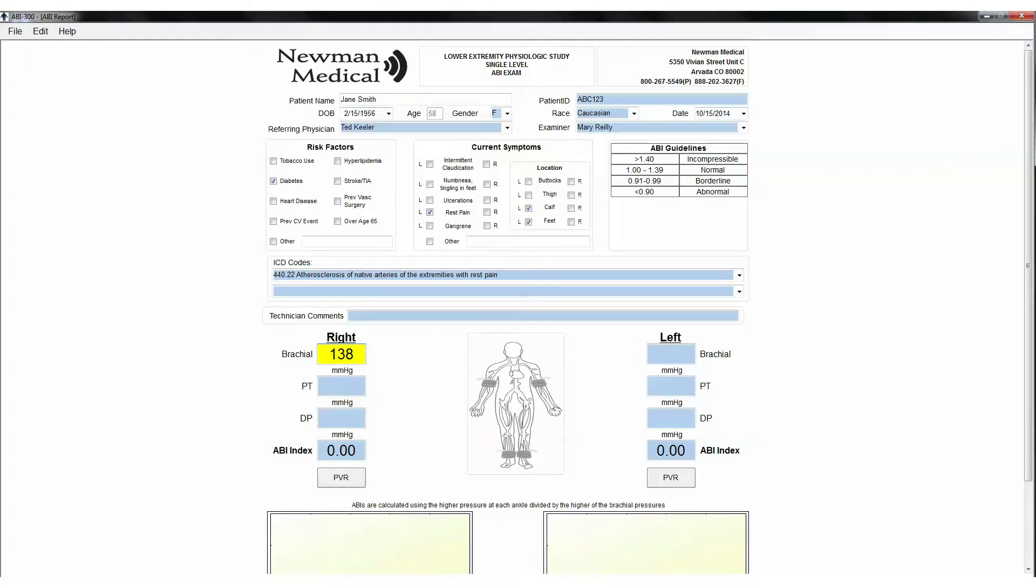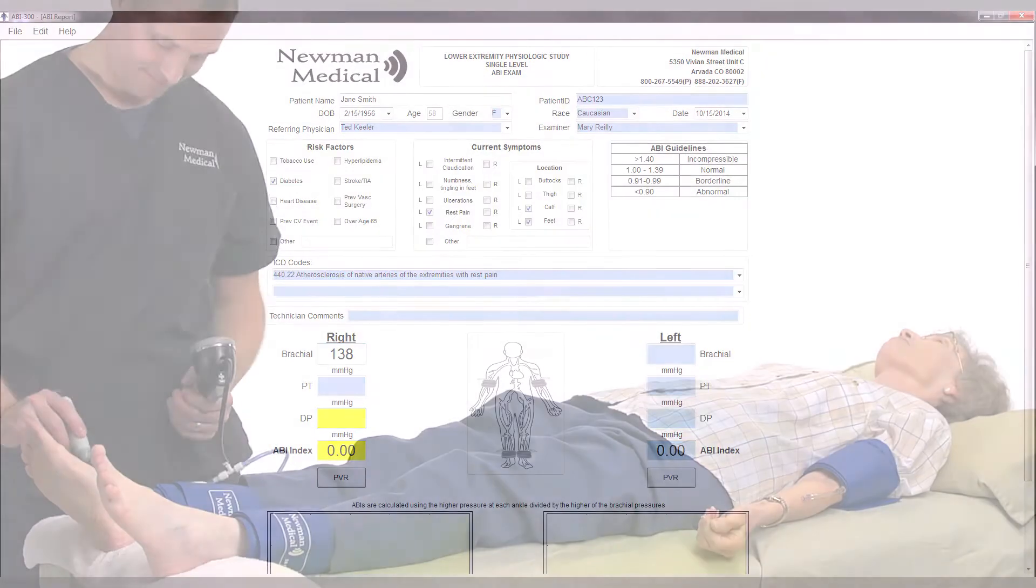If you want to repeat the pressure measurement, simply repeat the process. When satisfied, use the cursor to move to the next site or press the tab button to move to the right DP.